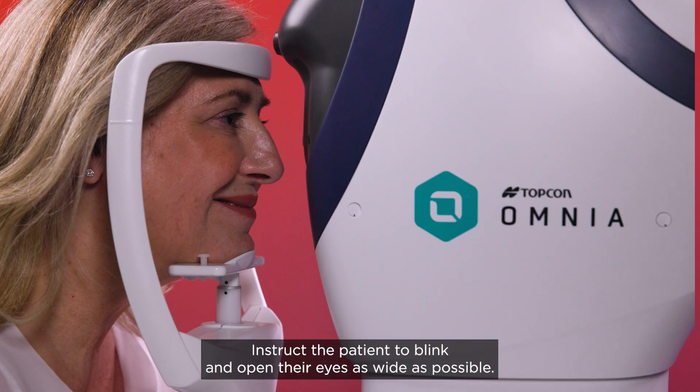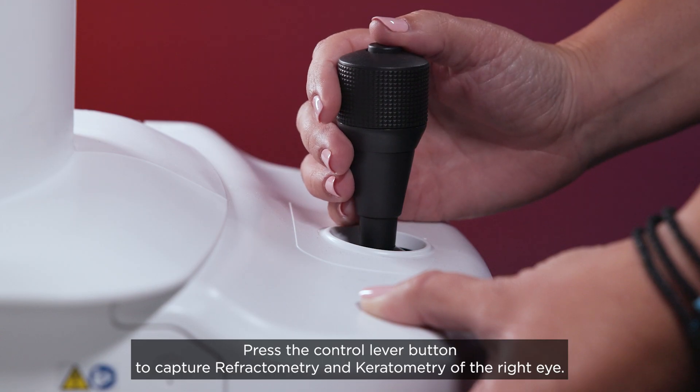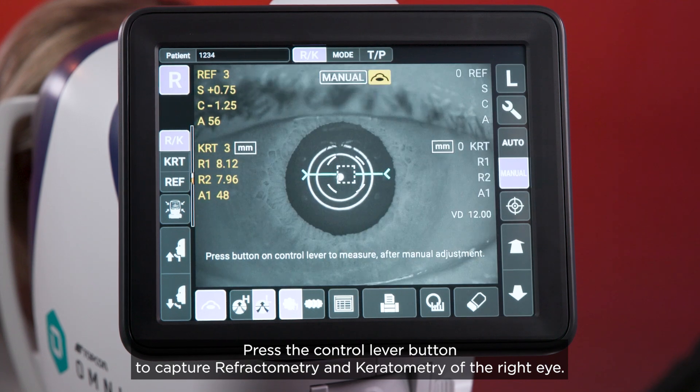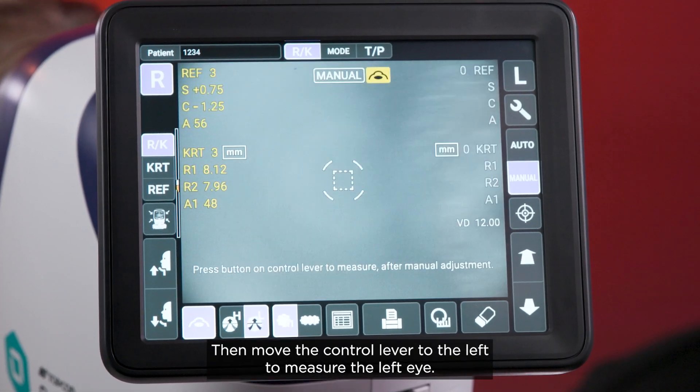Instruct the patient to blink and open their eyes as wide as possible. Press the control lever button to capture refractometry and keratometry of the right eye, then move the control lever to the left to measure the left eye.